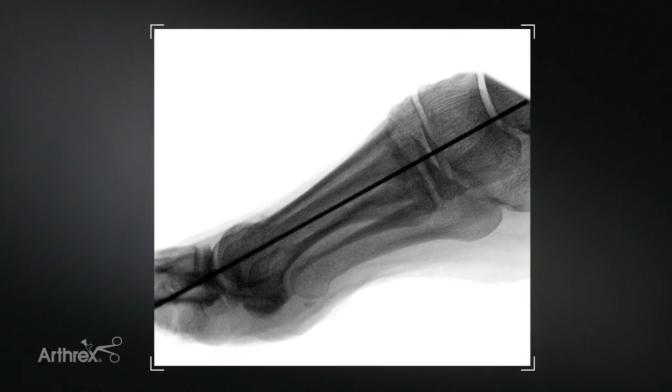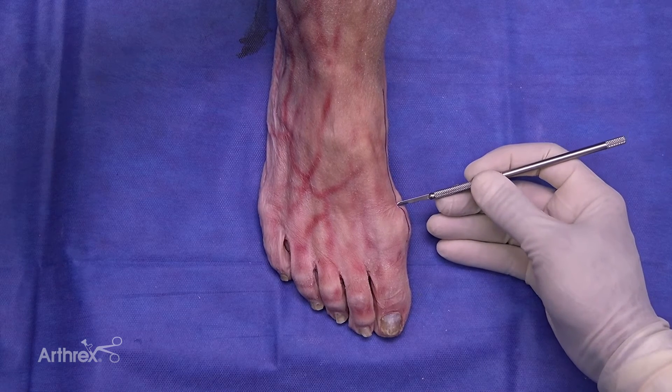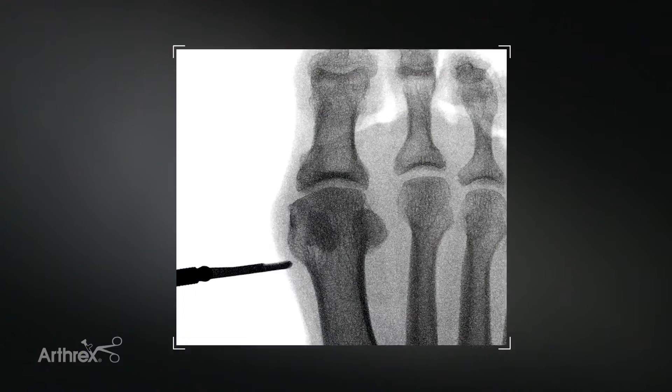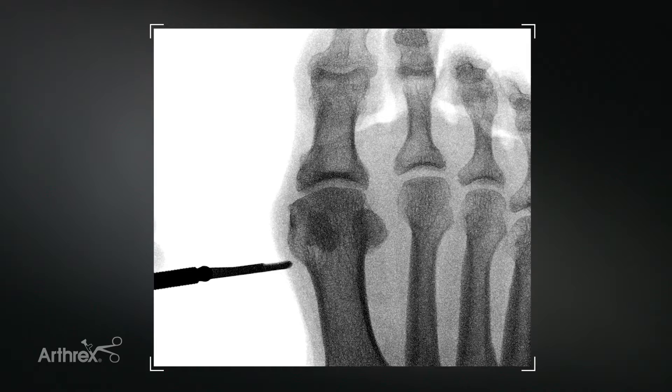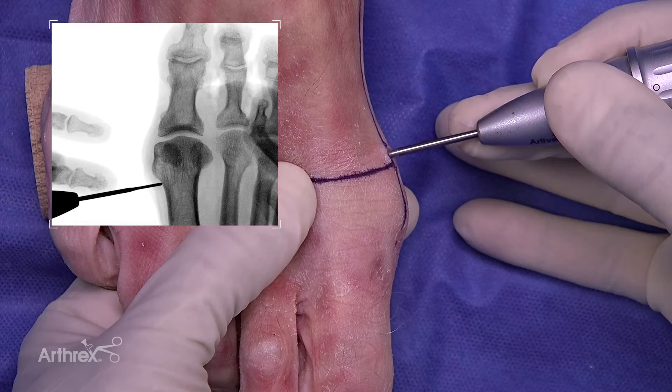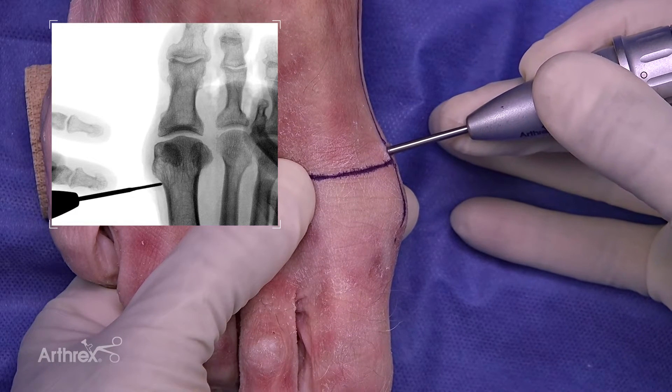It is important to get a good lateral x-ray so you can draw a midline of the long axis of the first metatarsal. You'll make the incision with your beaver blade that's provided in the set — it's a stab incision. I tend to make it approximately two centimeters from the MTP joint. To complete the osteotomy, I find my point and then I carry out the cut.